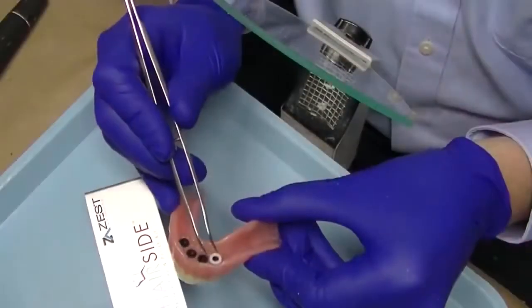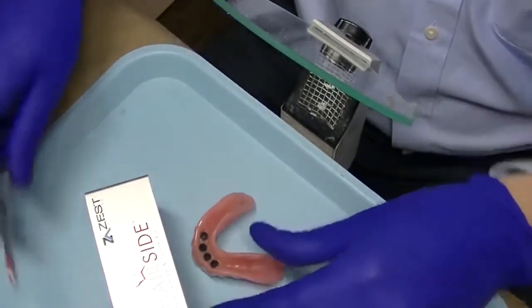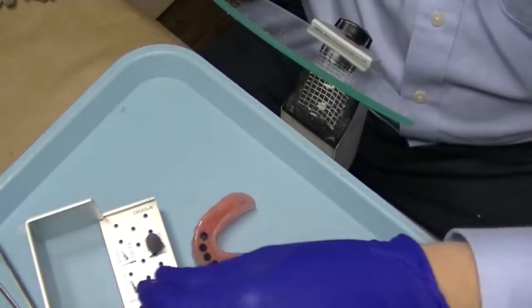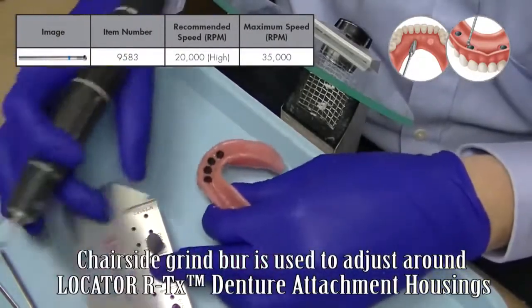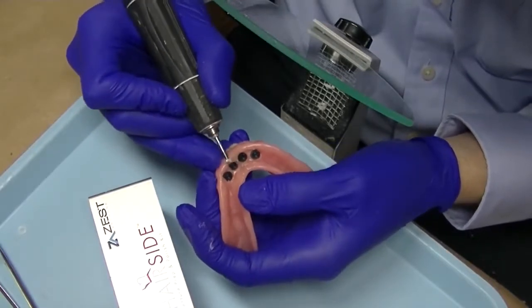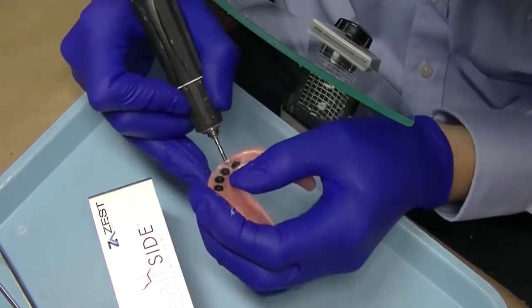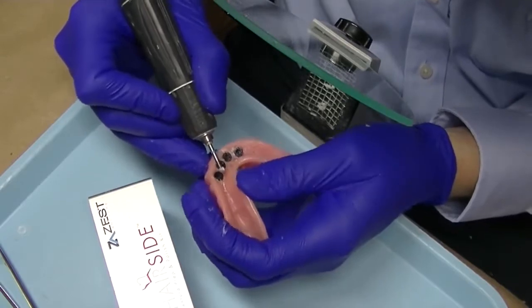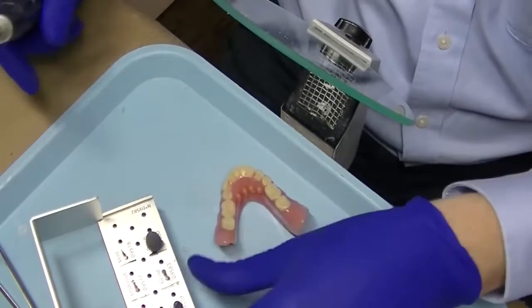Taking the denture to the laboratory, I can start to clean up any areas of resin flash in and around the complete denture or RTX housing. The first step is as I take the grind burr. The chairside grind burr is essentially a very specialized round burr that is perfectly suited for trimming any areas of the chairside attachment processing resin in and around the Locator RTX housing. Using the grind burr carefully, it removes just the amount of flash necessary without damaging the complete denture.